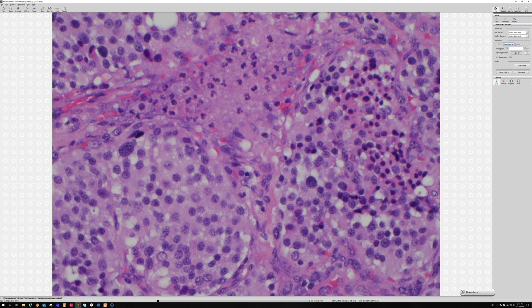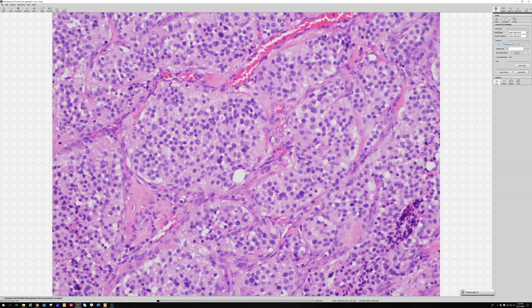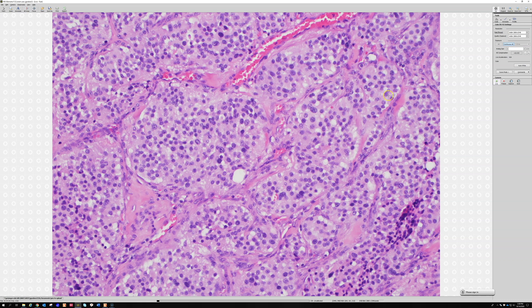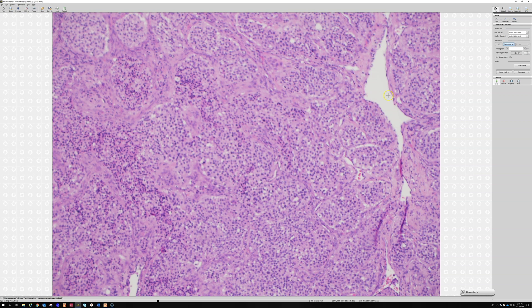What immunostains would you want to do here? Any neuroendocrine marker — yeah, synaptophysin and chromogranin will be positive. An interesting thing: if you do S100, a lot of times you'll get scattered S100-positive cells around the outside of each of these nests or zellballen packets — those are called sustentacular cells. I've seen cases where it was clearly a paraganglioma but that stain didn't work very well; when it works it's great, but it doesn't always look as beautiful as illustrated in the books.